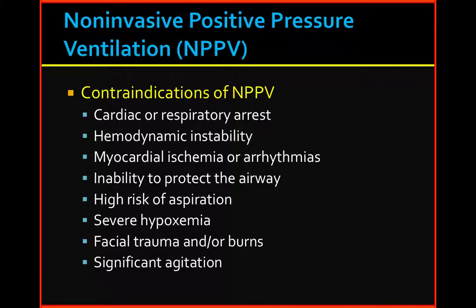Here's the point though. There's many different ways to put air into somebody. We can say we're gonna put air into somebody based on volume. So we're gonna put a certain X amount of volume into somebody and then let it come back out. That's one way of doing it. Another way of ventilating somebody is saying, we're going to inflate them to a certain pressure. So we're gonna have this ventilator put a certain amount of pressure into the patient, and then when that pressure is released, it's gonna come back out.